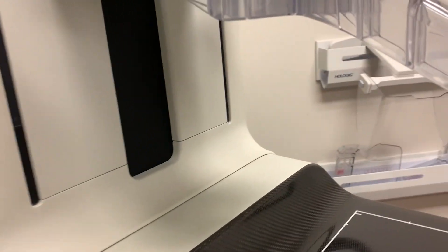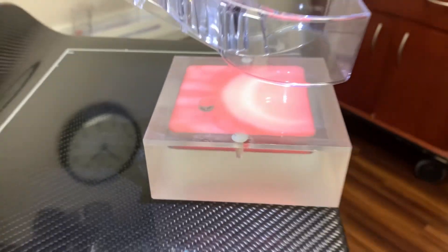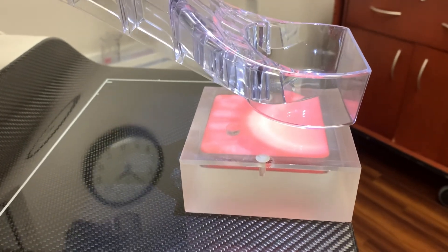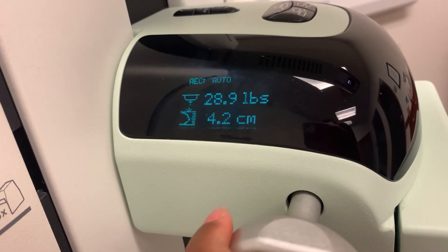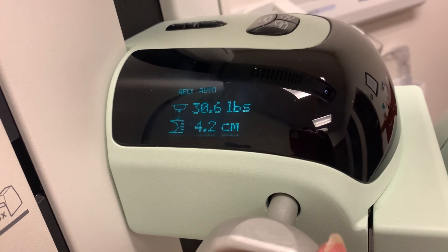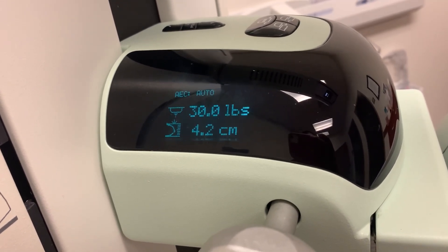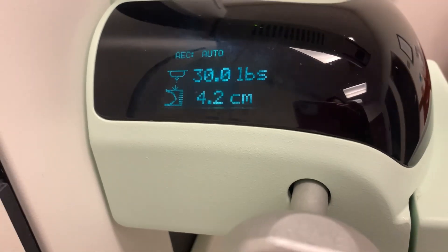Now I'm going to come down to about 30 pounds. I'm coming down slow. You see the pounds right here. It's going to start feeling tight, but I'm going to 30 — that's what the Mammie would say. Just try to get it to 30 as much as possible. And then you record your centimeters for the breast thickness, which is 4.2.